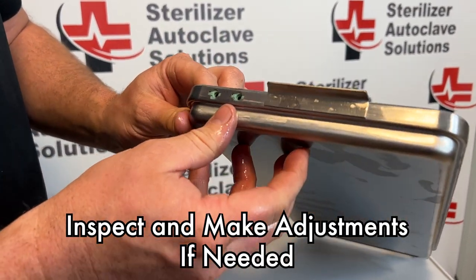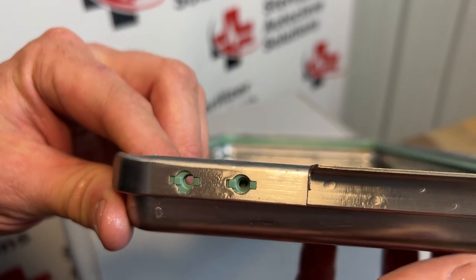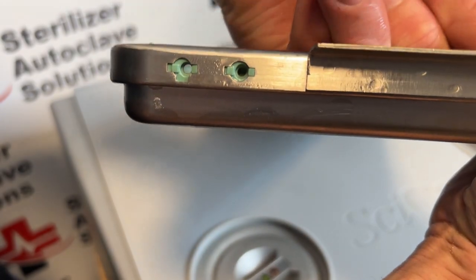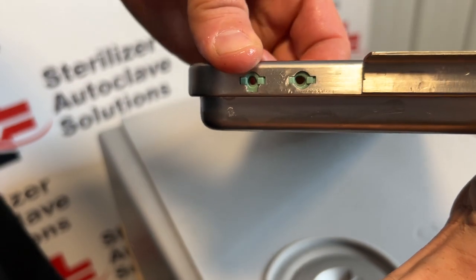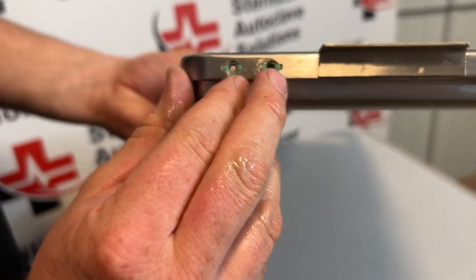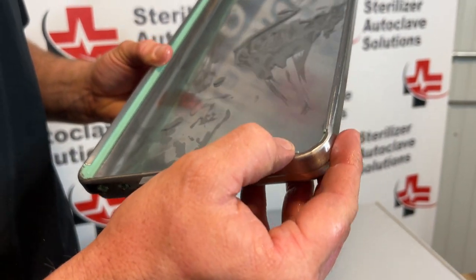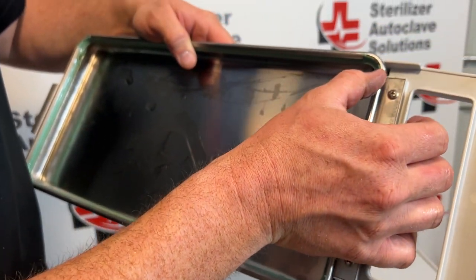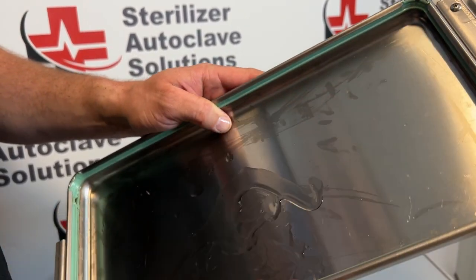Last thing we're going to do is inspect. We can see how this hole is off, so I'm going to come on the back side and push, and it will actually slide into place. Our back holes are good. We're going to check all of our corners and make sure all of our nubs are in place. If they are not, then we are going to slide in whatever direction we need.